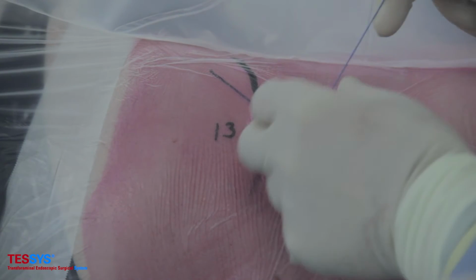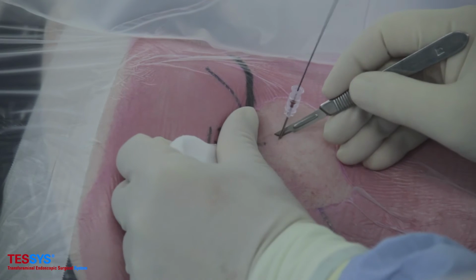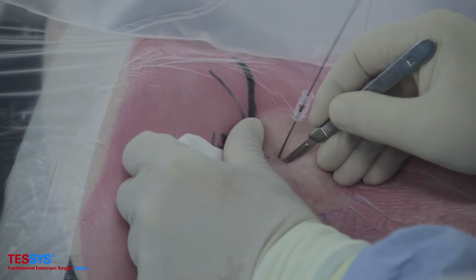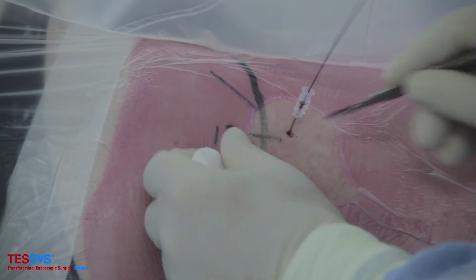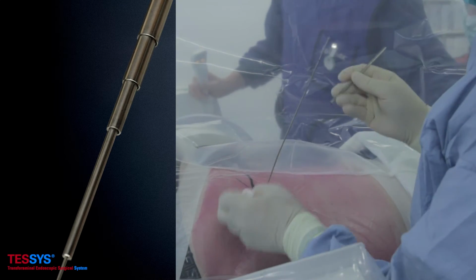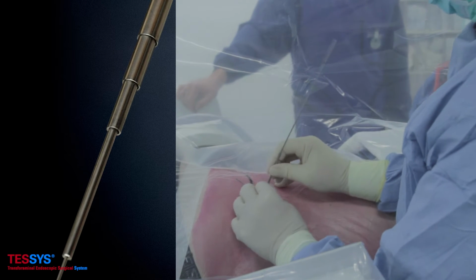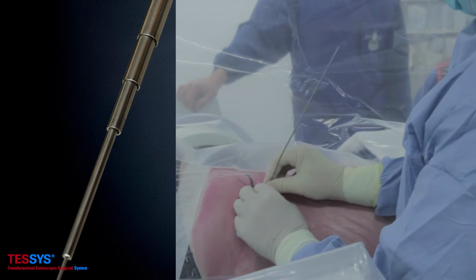A guide wire is then inserted in the needle and an 8 mm incision is made. The needle is removed and over the remaining guide wire, the conical green rod is inserted.